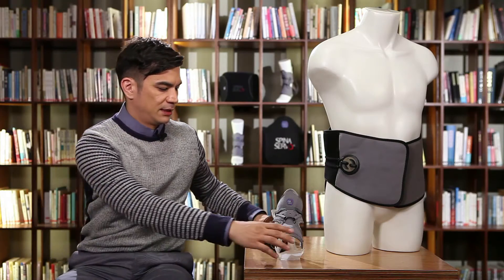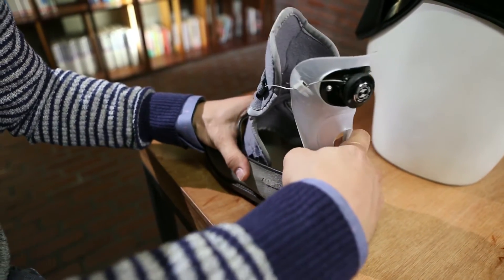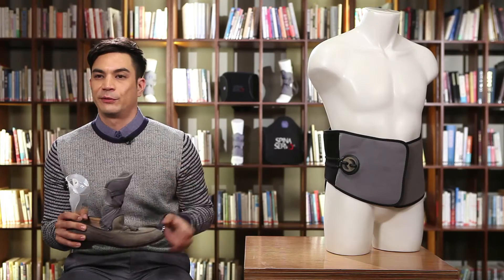I'll give a demonstration to show you just how easy it is to put on the AF Servo. First, I've got to take off my shoe. Next, I'm going to take the AF Servo and put it inside the shoe. Then I take the dial and pull it out until it makes a click. What that allows me to do is helps me pull the AF Servo apart.